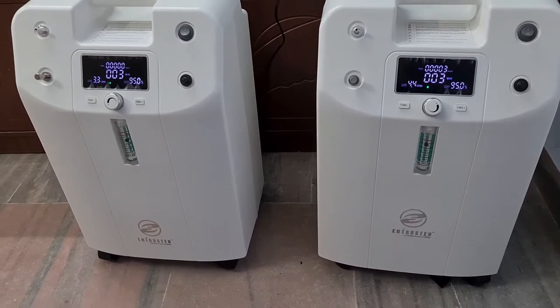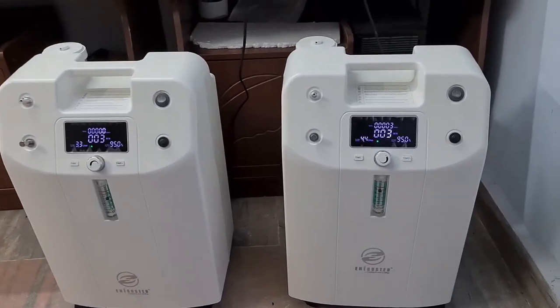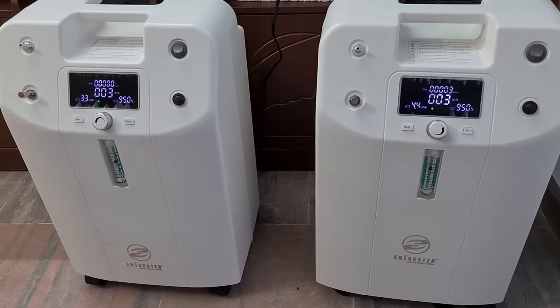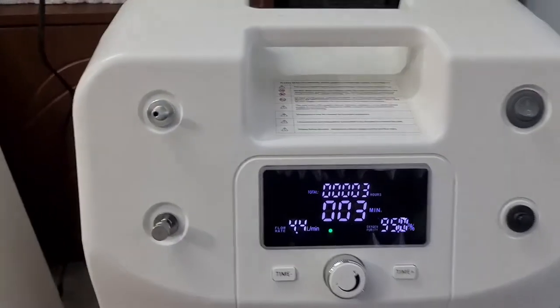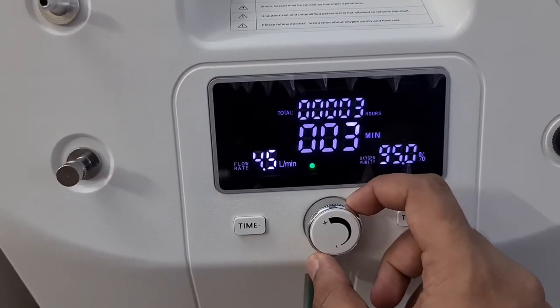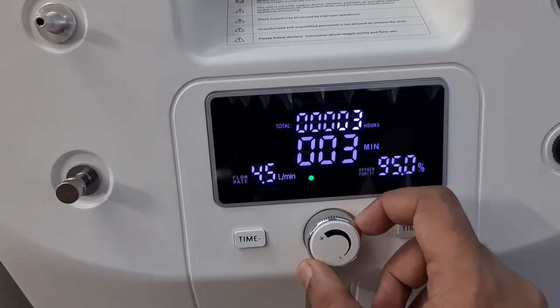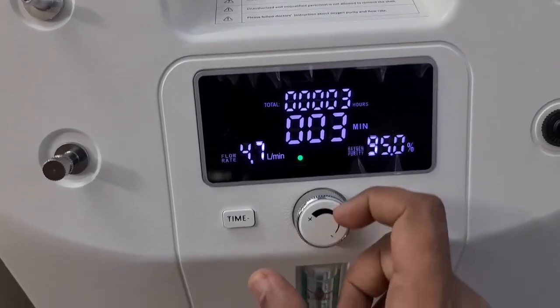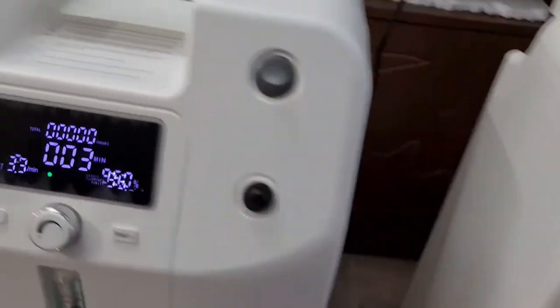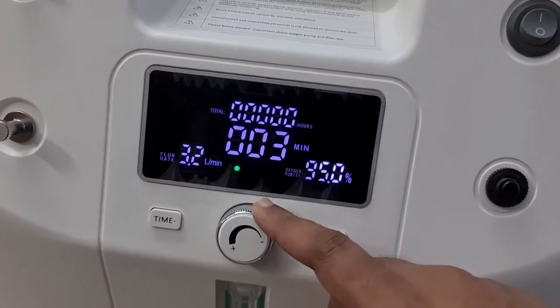Now let us see how to connect two 5-liter machines. For the demonstration we have two Oxy Care digital models. You can see the flow rate here is 4.4 — let us increase this and make it 5. Give some time for the digital version to increase. Similarly, in this concentrator also we will keep it to 5.